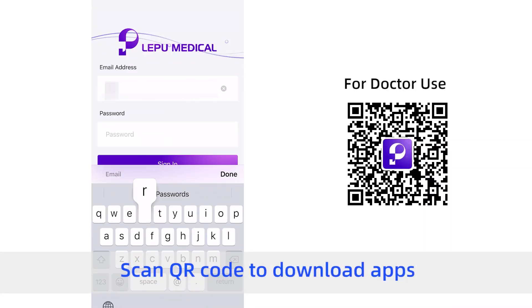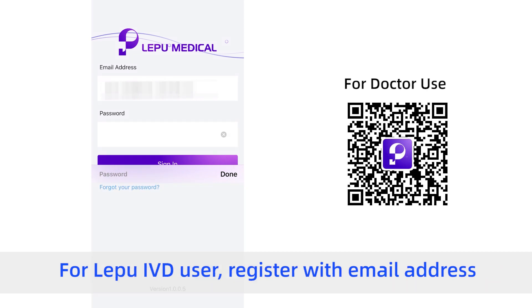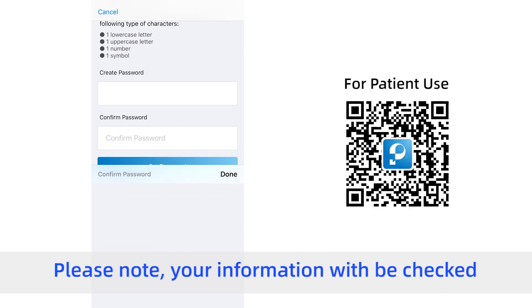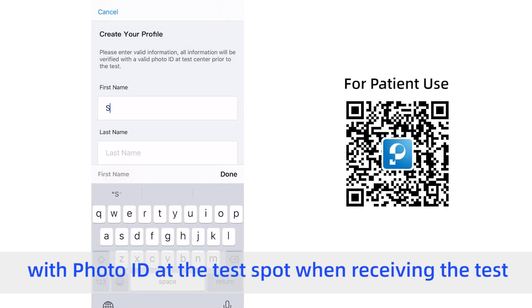Scan QR code to download the app. For doctors, sign in to Lepu IVD Doctor with your credentials. For Lepu IVD users, register with your email address and fill in personal information correctly. Please note: your information will be checked with photo ID at the test spot when receiving the test.